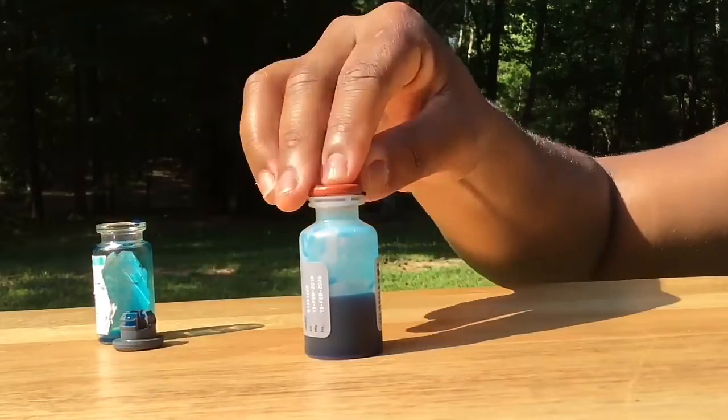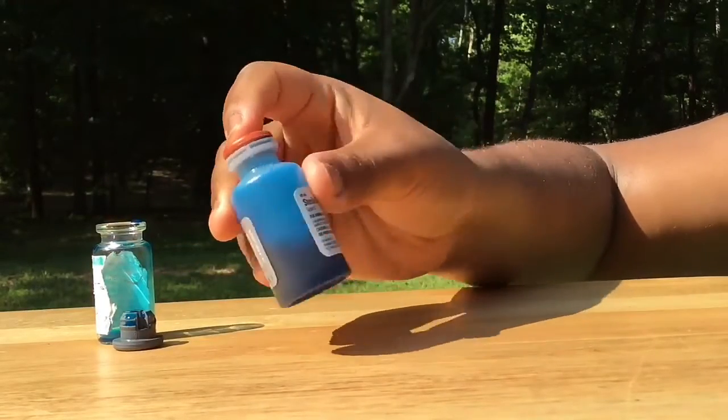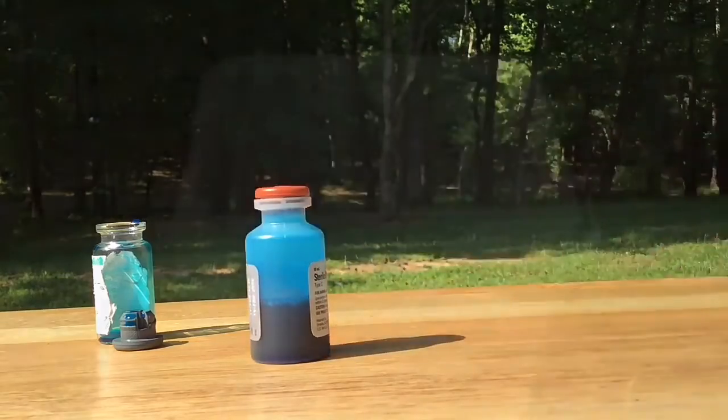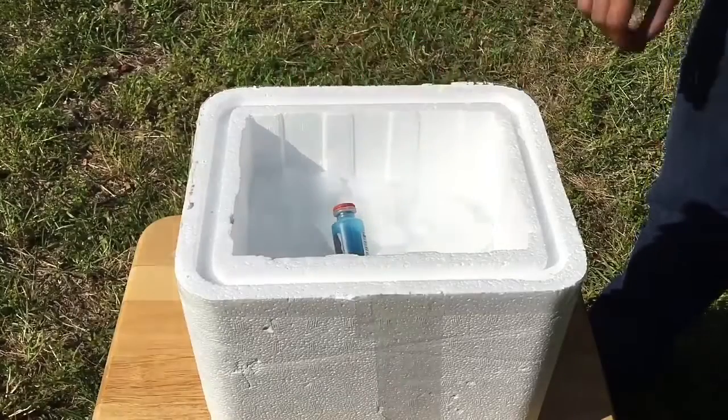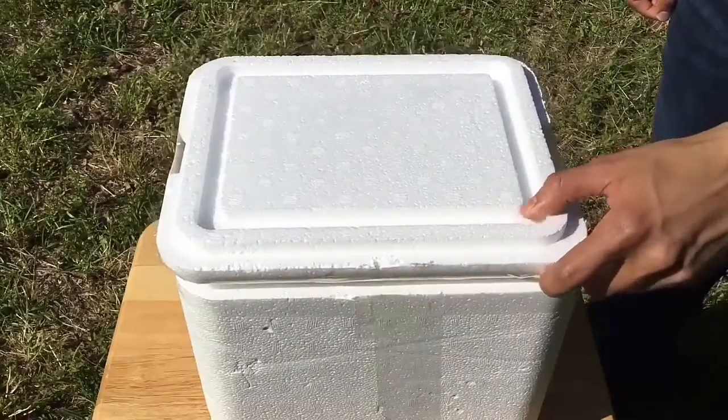Put the lid back on and shake briefly. After mixing your vaccine, place it on ice and keep it cool between each bird that you vaccinate.